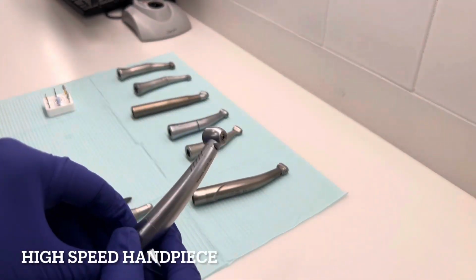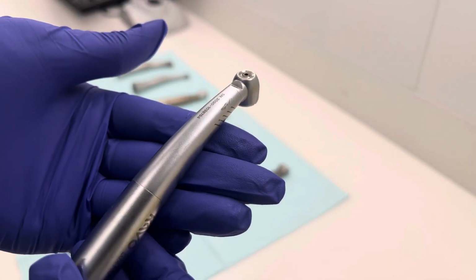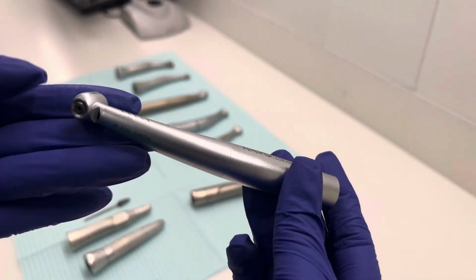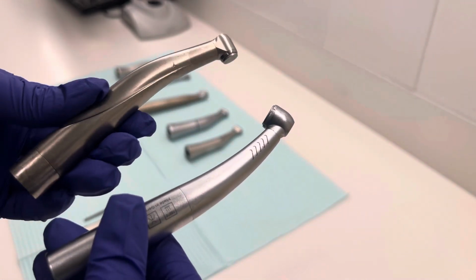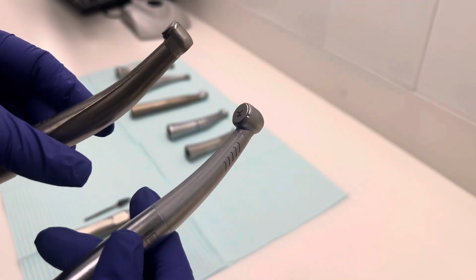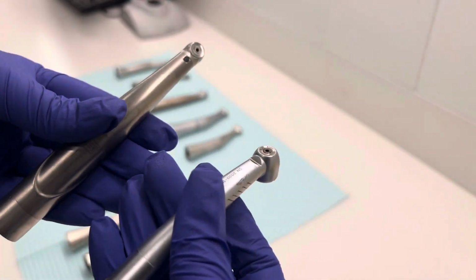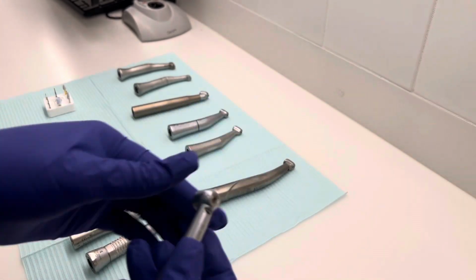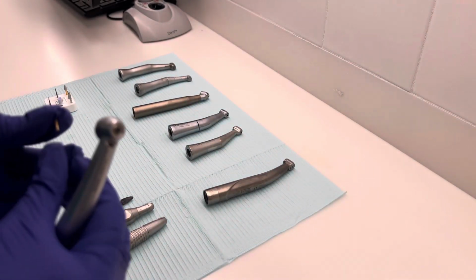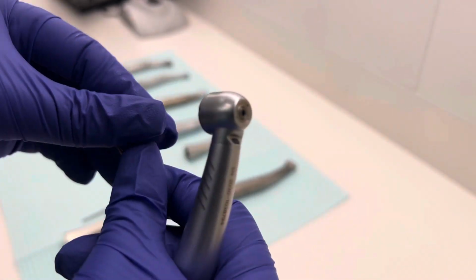Okay, moving on to high-speed hand pieces. These are usually used for cutting and shaping dental materials such as enamel, dentin, and ceramics as well. They come in different shapes like these. You can see one of them has a smaller head, the other one is slightly bigger. They kind of look the same at the back, but for the most part, it's usually the shape of the head. It's the same thing, does the same job. So I'm going to show you how to put a burr in there. And it usually works with burrs such as these.